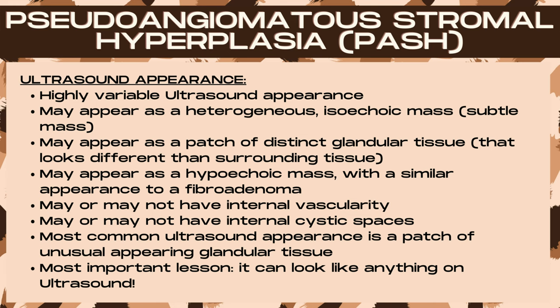It can appear as a heterogeneous isoechoic mass, which is often subtle, or as a patch of distinct glandular tissue that looks just slightly different than the surrounding tissue. It may appear as a hypoechoic mass with a similar appearance to a fibroadenoma, and may or may not have internal vascularity or internal cystic spaces. The most common ultrasound appearance is a patch of unusual-appearing glandular tissue with very subtle differences from the surrounding tissue.